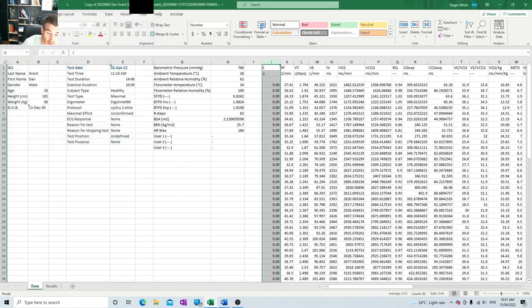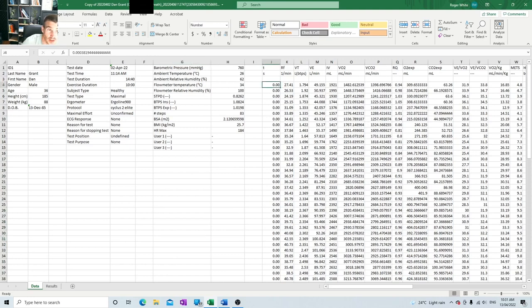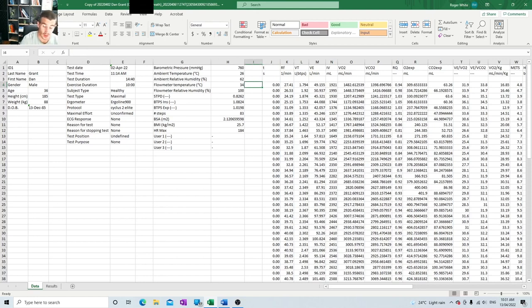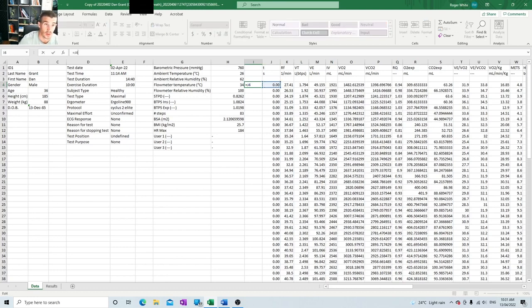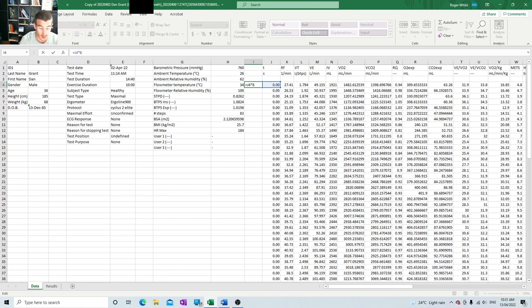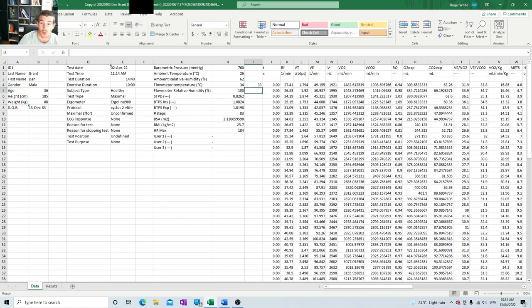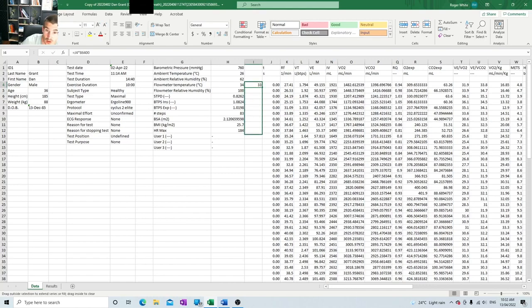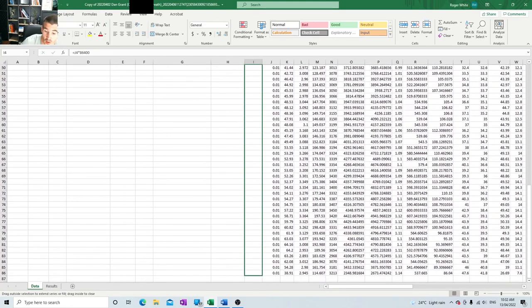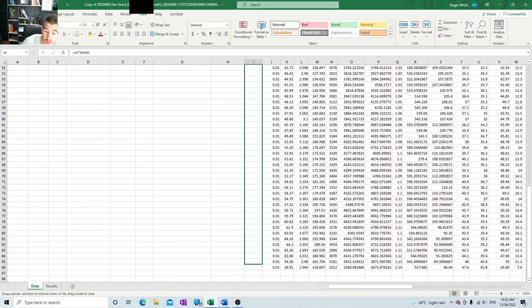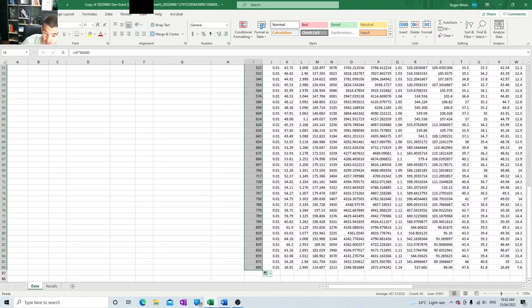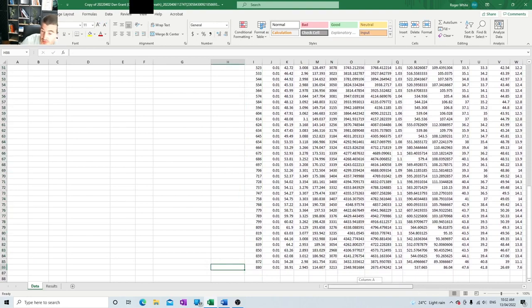So you're going to get a whole heap of zeros here. That's actually not quite zero. That is 0.0003819. Now to convert that into seconds, we go equal, we multiply that result by the number of seconds in the day. So there's 86,400 seconds in a day, which works out at 33 seconds. So at 33 seconds, this was their data. Then we just copy all that, all the way down to there. So the whole test took 880 seconds.